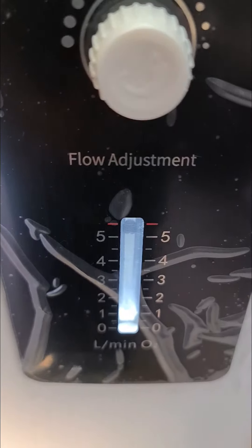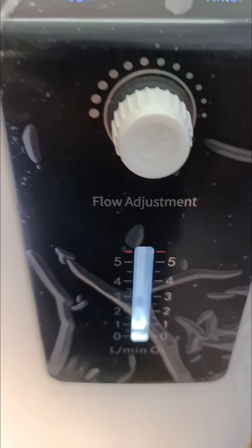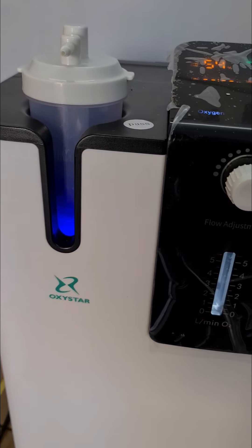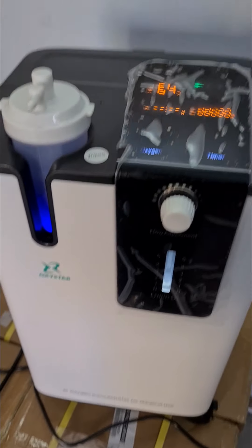Always keep the flow rate as per your doctor's advice — don't set it according to your own preference. Some people think that keeping it at 5 is best, but that is not the case — each person's lung volume is different. If the doctor advises 1 or 2 litres per minute, keep it at that level. Rotating anti-clockwise increases the flow rate; rotating clockwise decreases it. Also, the sound every 8 seconds is a flushing sound — it indicates the machine is working properly.